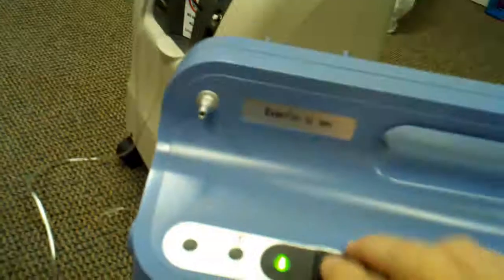I did turn this unit on. You can hear it's very quiet. It's set at 5 liters per minute, which is the max. All you've got to do is turn it down. You can see the little internal ball is going down to 1 liter. I'm going to go ahead and turn the Everflow Q off.